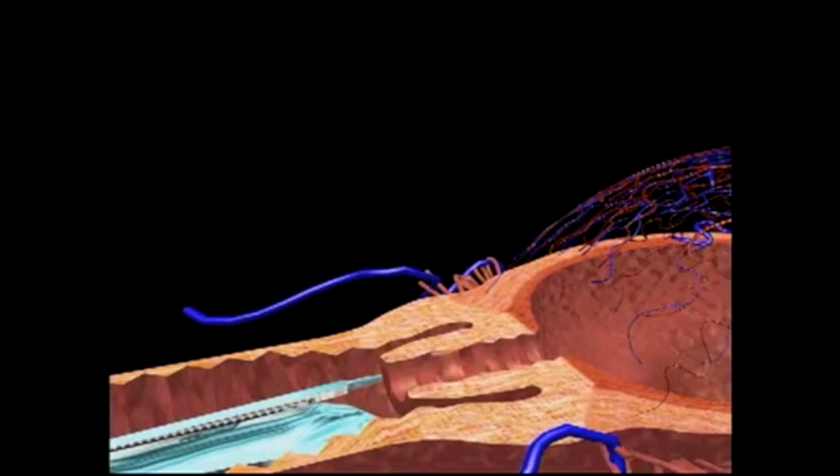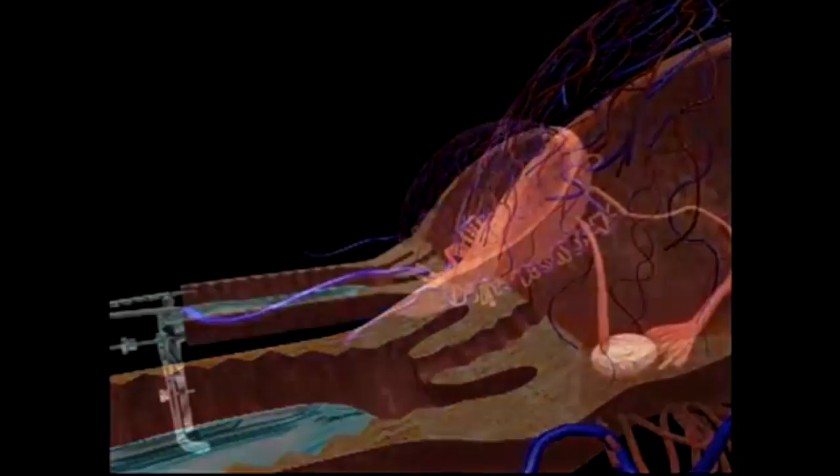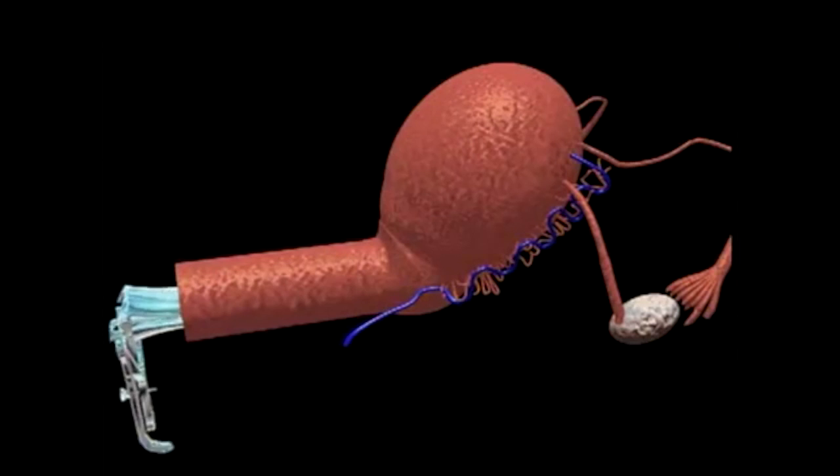When the uterus is empty, the tenaculum is released, and the uterus returns to its normal position. After the speculum is removed, the procedure is complete.